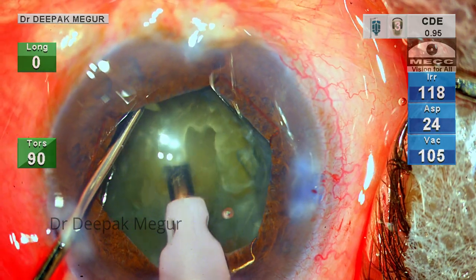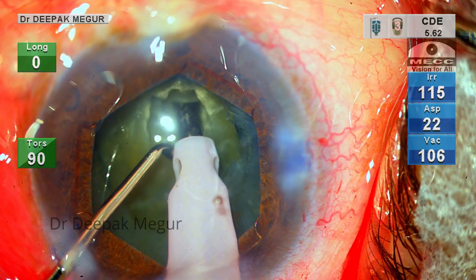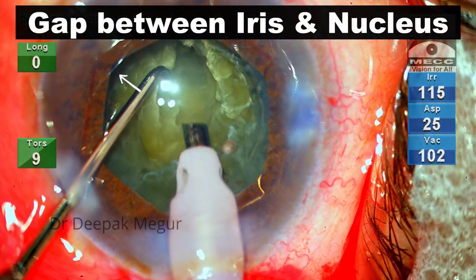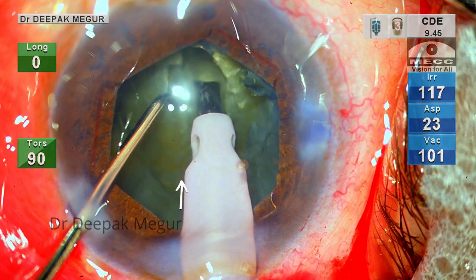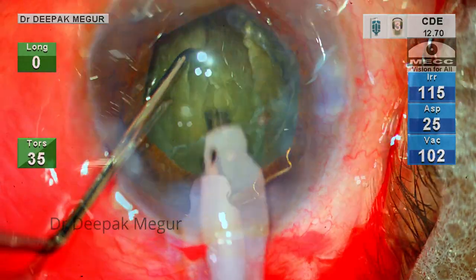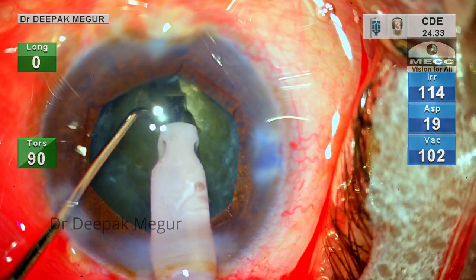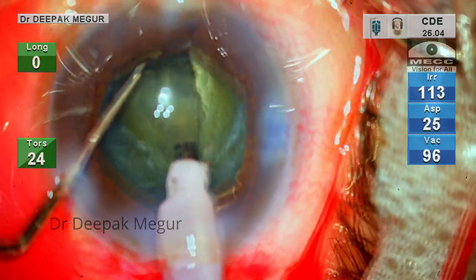As I aspirate the epinucleus and begin to sculpt, I notice that maneuvering the nucleus is not easy at all. The nucleus is at a significantly deeper plane — one can notice the excessive space behind the iris. When sculpting, the whole bag moves forward along with the forward stroke of the phaco tip. The wobbliness of the bag decreases once I stabilize the nucleus firmly with my second instrument.